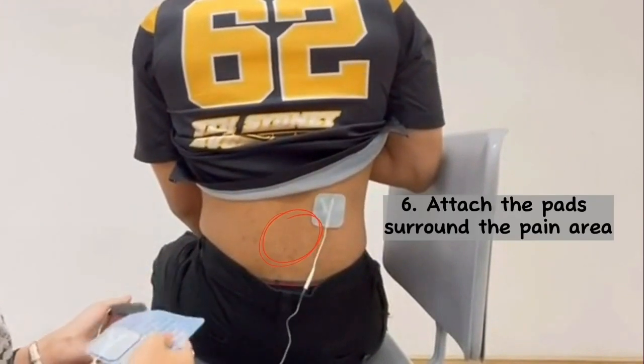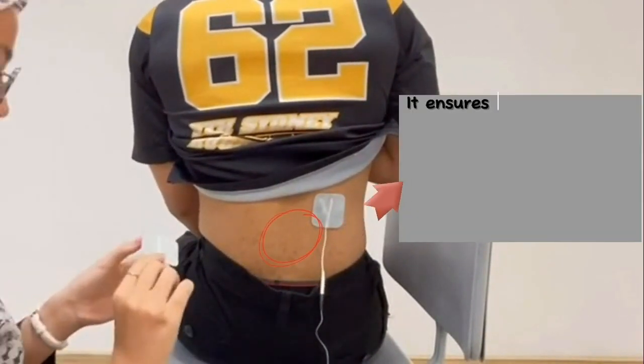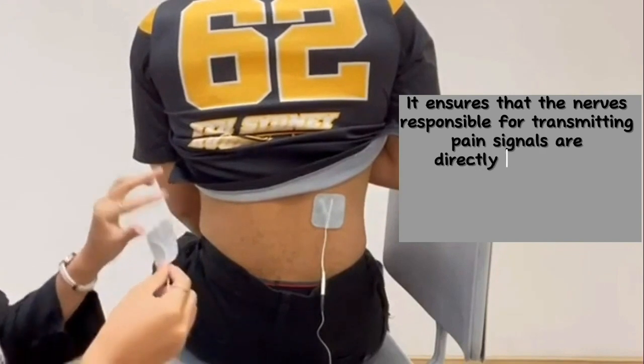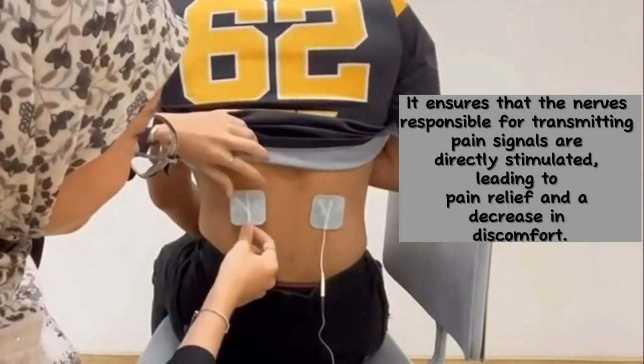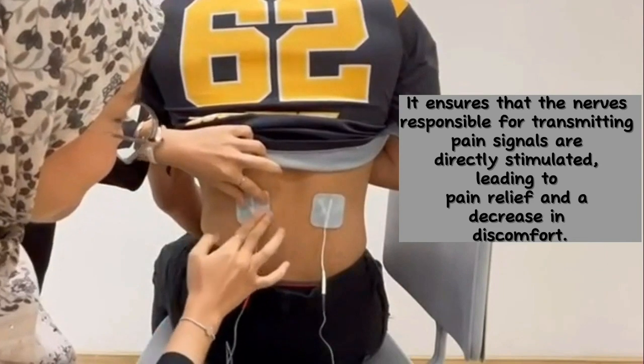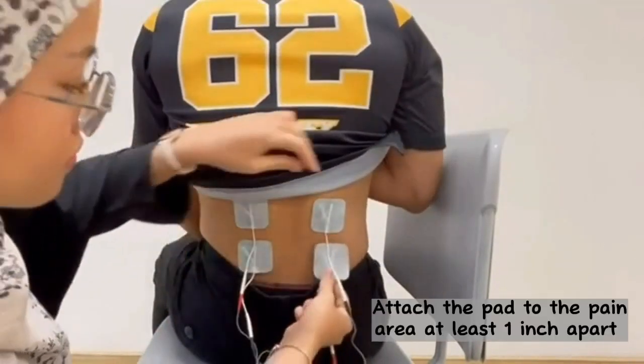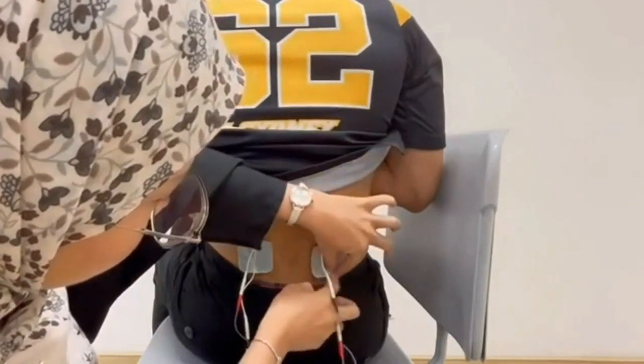Attach the pads around the pain area. Placing the pads around the pain area ensures that the nerve responsible for transmitting pain signals are directly stimulated, leading to pain relief and a decrease in discomfort. Make sure to attach the pad to the pain area at least one inch apart.